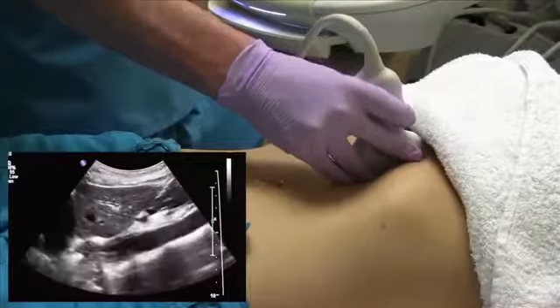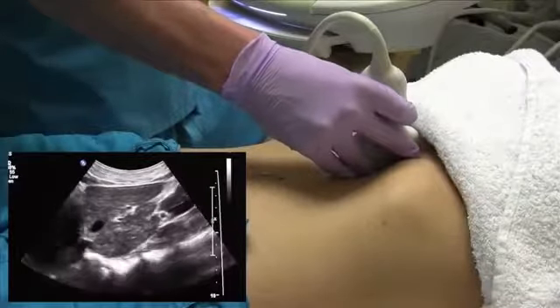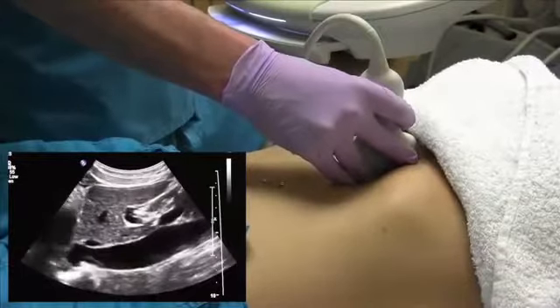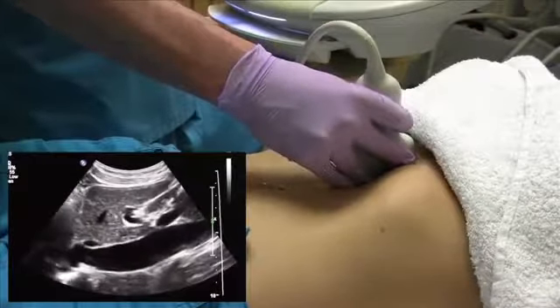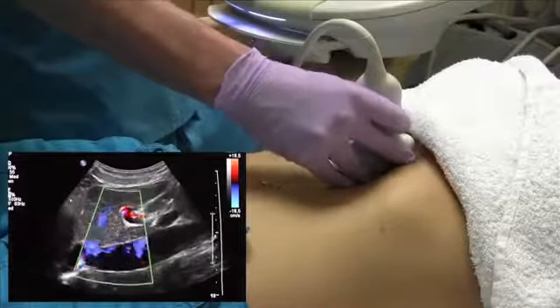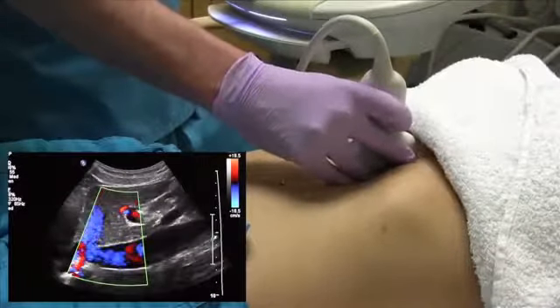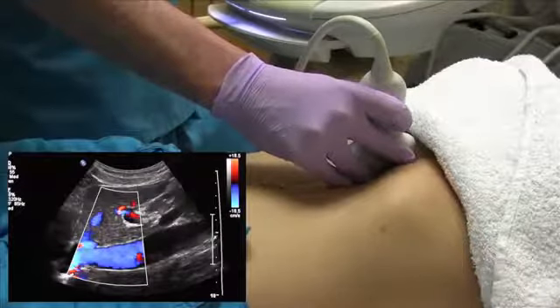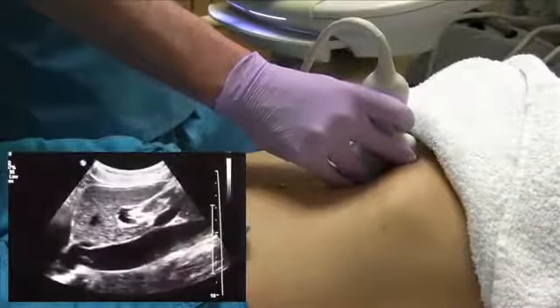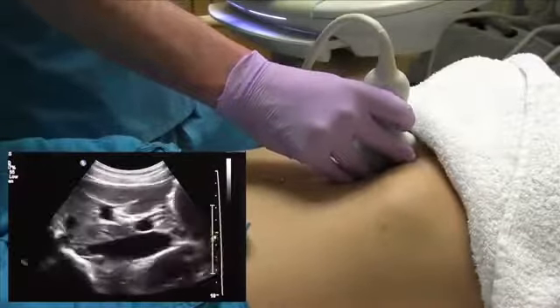Still sweeping more medially, you're going to start to see the IVC, and you'll see the caudate lobe. And we usually put color on the IVC just to make sure that it fills completely. This is our last picture of the sagittal left lobe here. From here we're going to start to come into the right lobe of the liver.